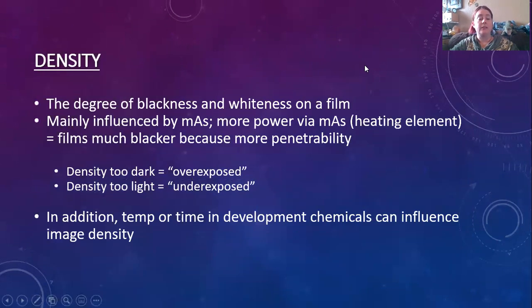For density, this is the degree of blackness and whiteness on the film. How black are our blacks? How white are our whites?